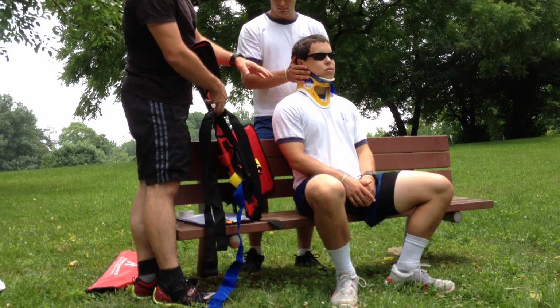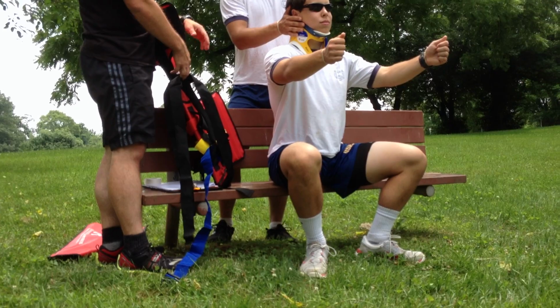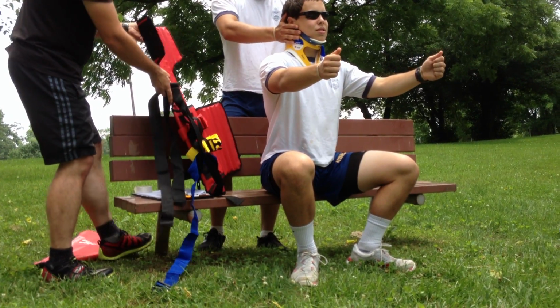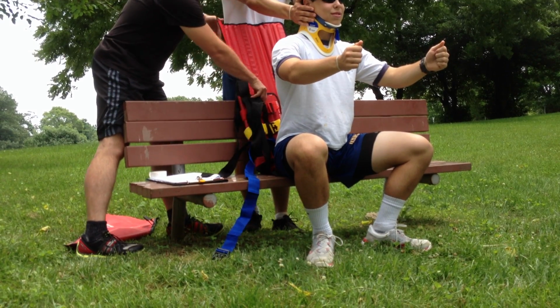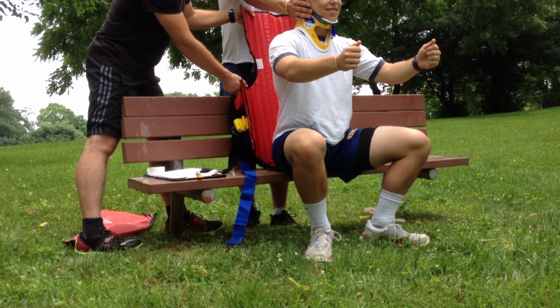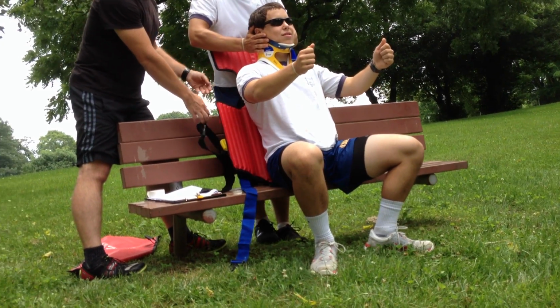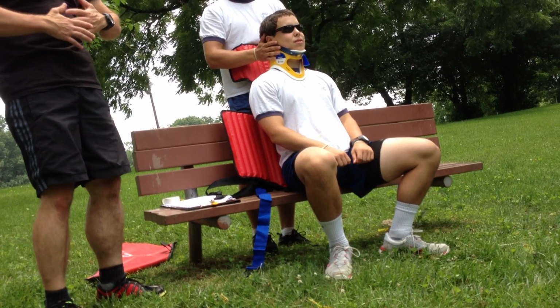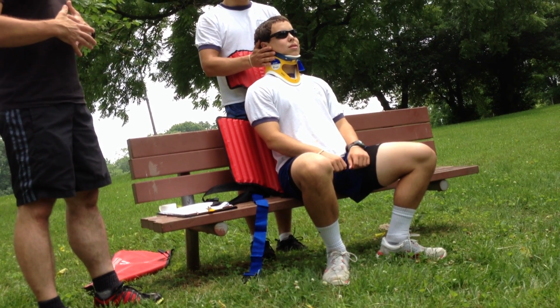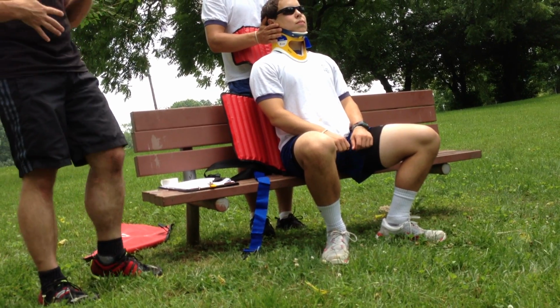All right, sir. What I'd like you to do is grab your steering wheel for me, please. Yeah, thank you. And I like how you're leaning forward there. I just need to position this behind you, just like so. All right, sir. You can sit back and lean against my device. All right, very good. And then I'm going to start the process by first just loosely buckling the buckles, just to get this thing in place.